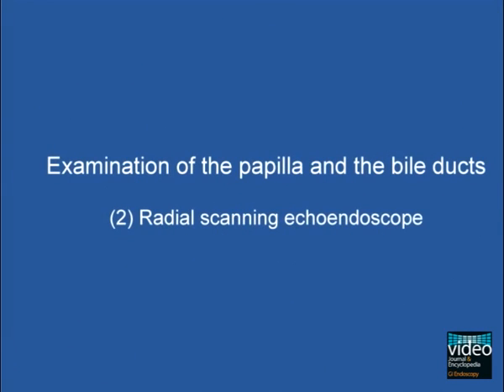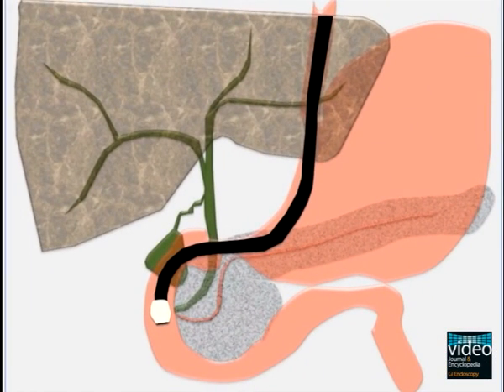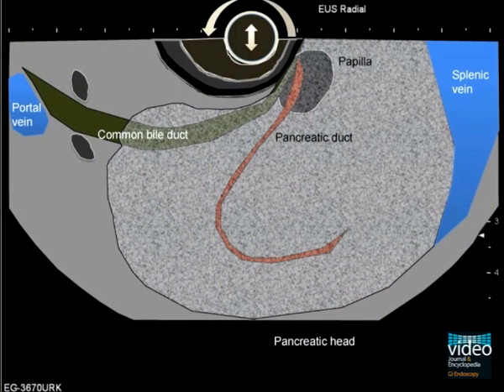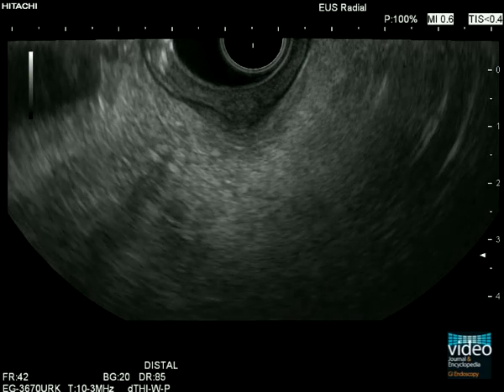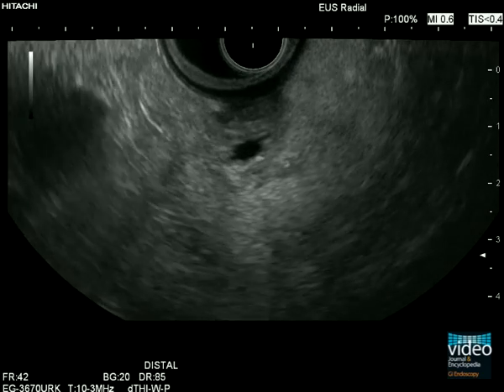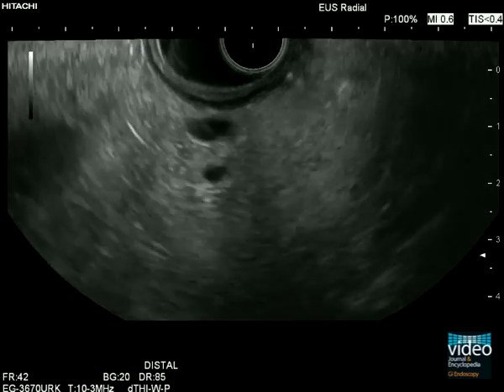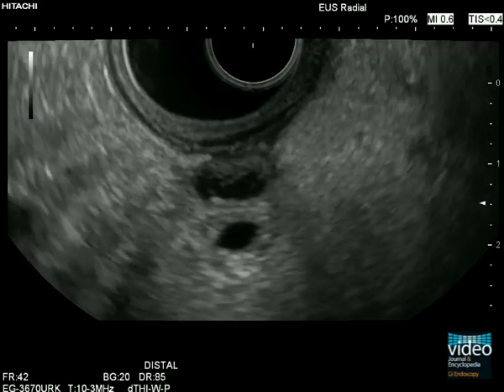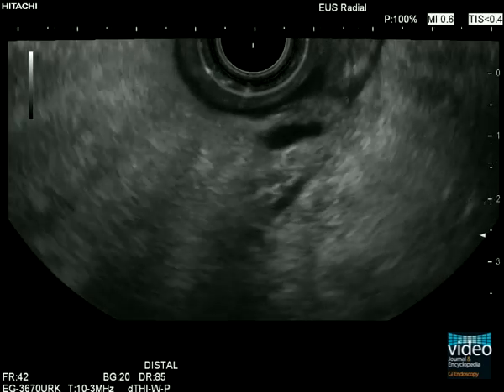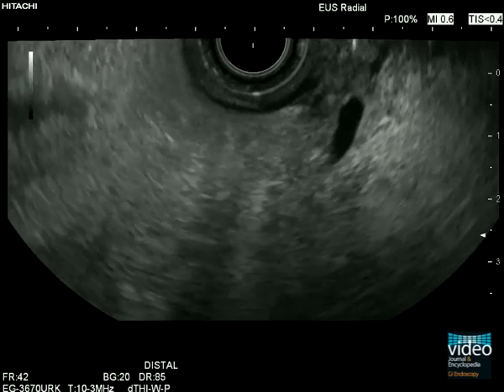Now we examine the bile ducts using a radial scanning echoendoscope. Again, we start at a position perpendicular to the papilla. The pancreatic duct runs away from the transducer through the pancreatic head. The course of the bile duct is directed onto the liver hilum at the left side of the screen. The radial scanner is located in the descending duodenum. Air is aspirated, and the scope slowly pulled back until it is in a straight position. Then the balloon may be slightly inflated. Very cautious forward and backward movements of the scope are necessary to focus the transducer to the papilla. The distal bile duct near the transducer, as well as the pancreatic duct distant to the transducer, appear in a cross or oblique section.